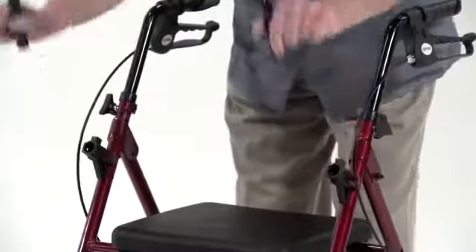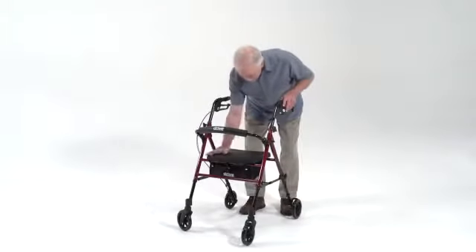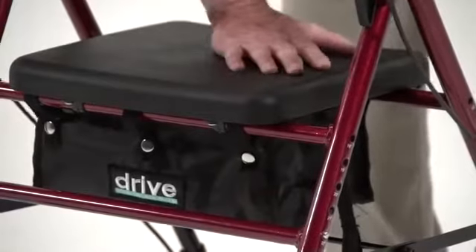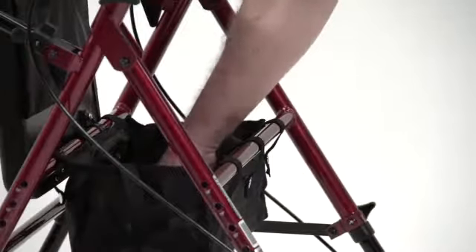The backrest is also removable and folds up or down as necessary. The padded seat is seamless to help prevent any unnecessary rubbing or scratching. Underneath the seat, it comes with a zippered carry pouch for added privacy and security of personal items.